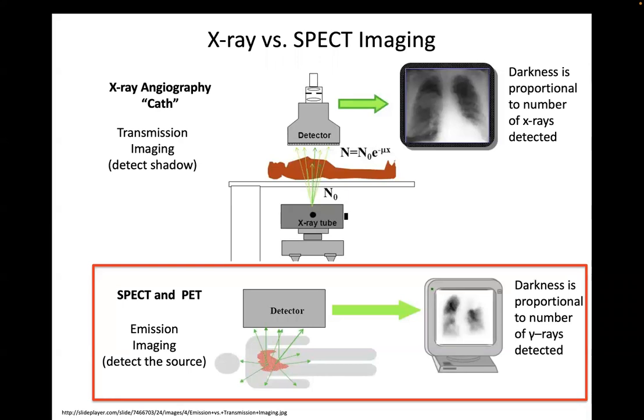And so you inject a liquid contrast agent into a patient, and it has a radioactive substance in it that emits very low energy gamma rays or high energy X-rays, about 140 keV. And the patient themselves is essentially glowing, and our eyes aren't sensitive to photons up there, but if you had glasses on that would be sensitive, that patient would be shining, amongst whoever is in the room.